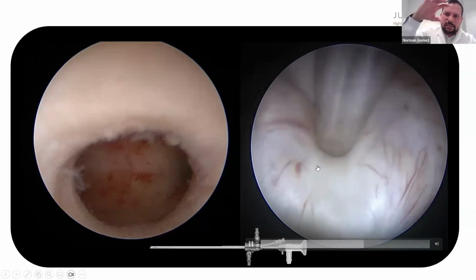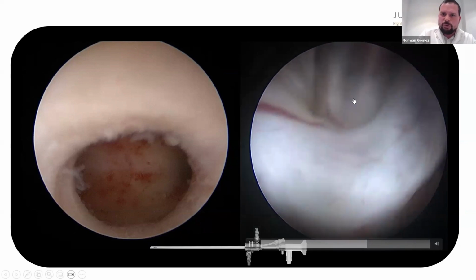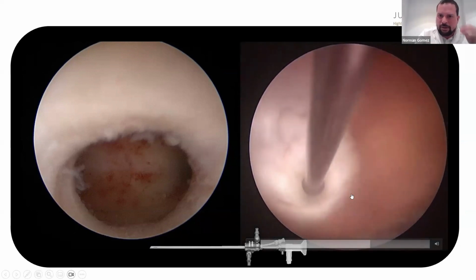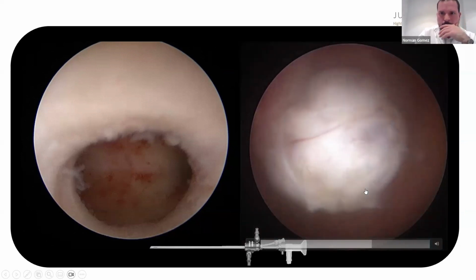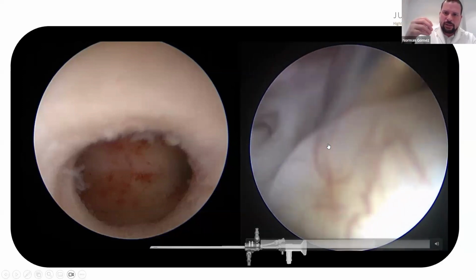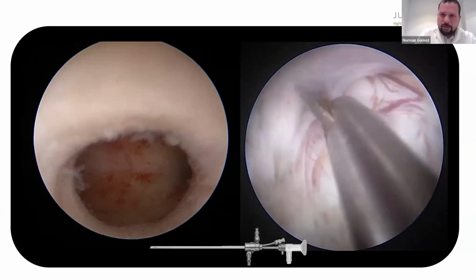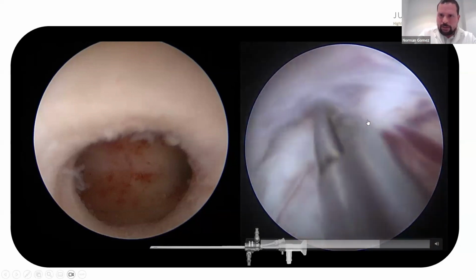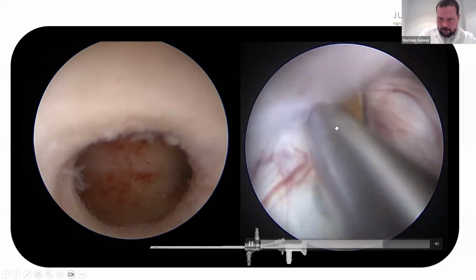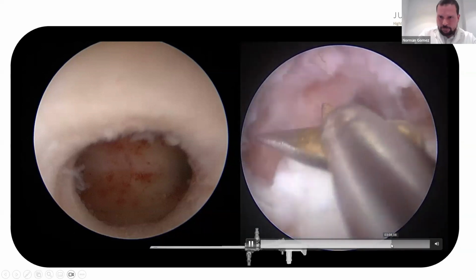When you detach all the surrounding tissue of the fibroid, you can use the tip of the scissors to pull the myoma inside the uterine cavity, as you can see here. Doing like this, you can break a lot of the attaching fibers of the myoma from the pseudocapsule, and you rotate the hysteroscope and try to cut the rest of the transverse fibers.